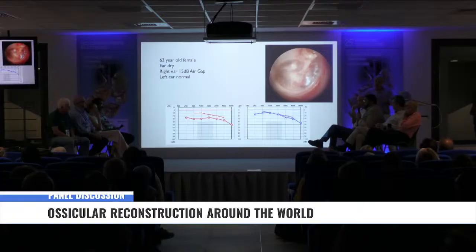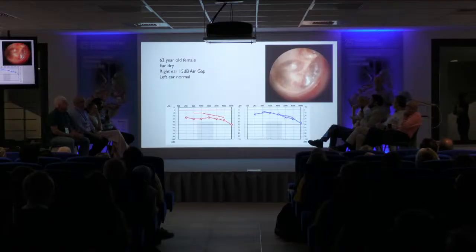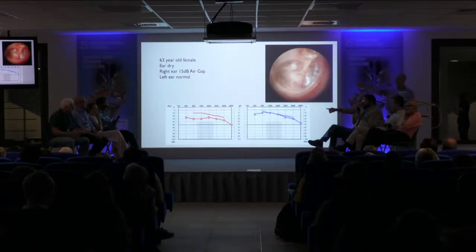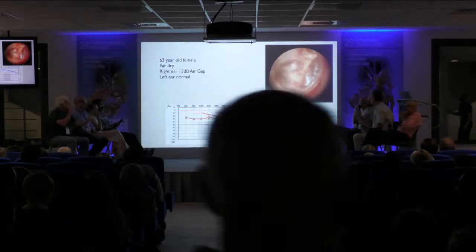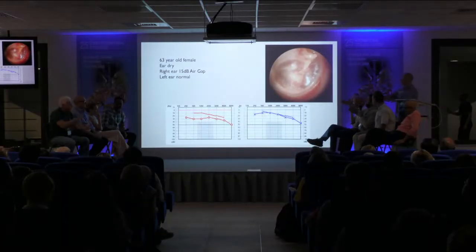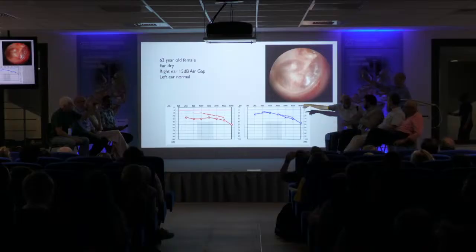But maybe can she convince you, though? Can she convince you to operate? She'll pay you thousands of euros, so the indication is okay. There's a gap there. So this is what we want. We want a full-on fight between them. And it's so easy to go straightforward. But let's put the cartilage. Let's take it.